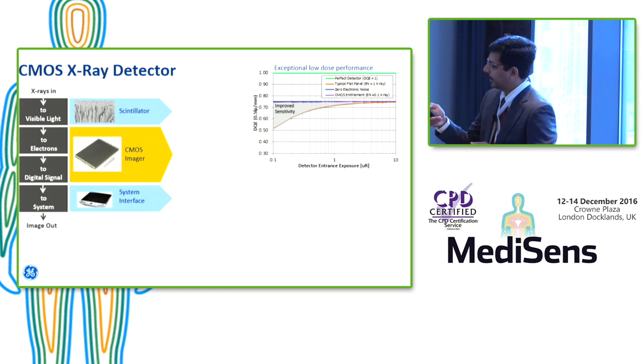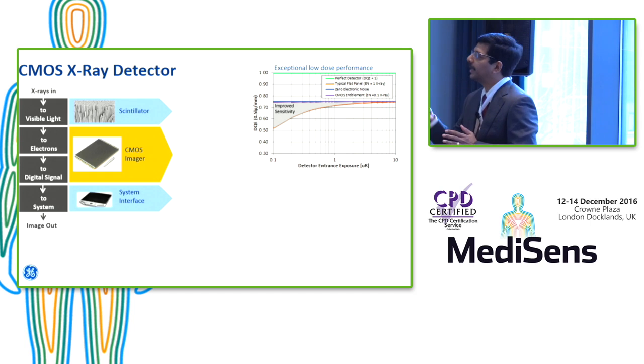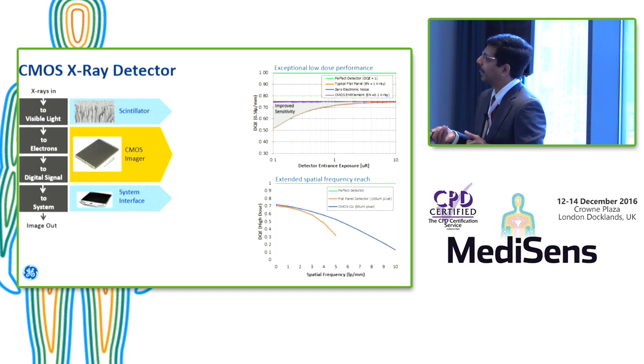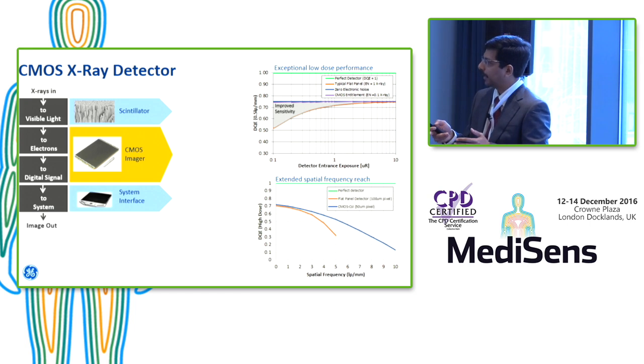So that really determines that the drop in DQE is significantly low. By the way, if you saw some of the presentations yesterday, this drop was a little bit more aggressive. There are reasons behind it. I don't want to go in right now, but this is the entitlement. Just to remember that. And again, that was in the axis of the exposure, but in spatial frequency, it's rather easy to go for a small pixel. It's no brainer. I mean, we're talking about 1 micron pixels today, so building a 50 micron pixel is not a big deal. So that will really help in extending the resolution.